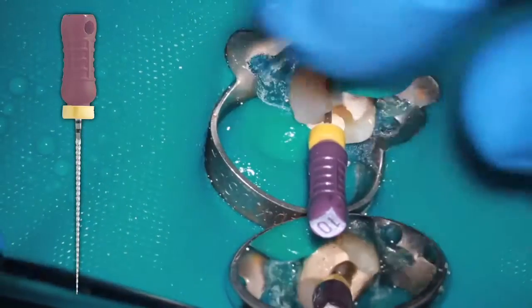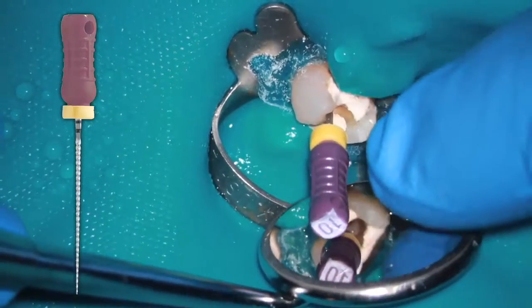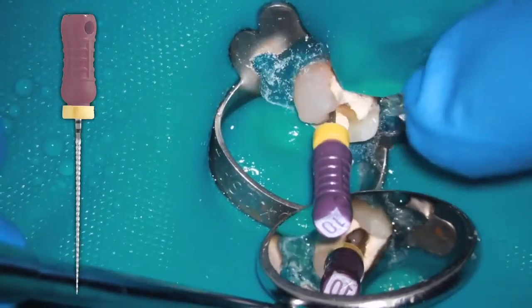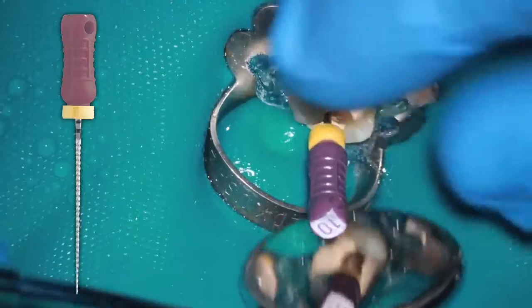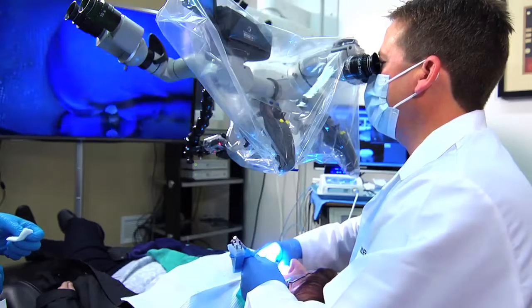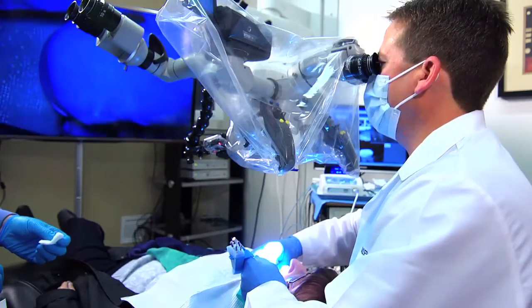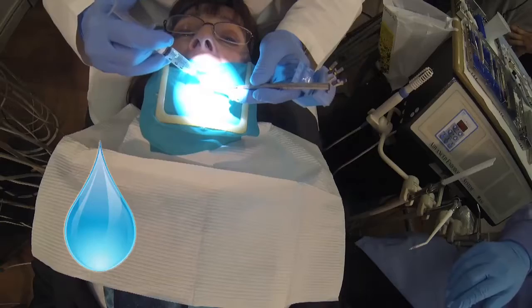What I just did was I just scouted through my coronal segment, thinking of the elliptical canal as two separate systems. So right now I'm working down the buccal aspect and feeling the curvature in my mid-third. Now I'm going to very gently come out and see if there's a similar feel coming from the lingual, which would demonstrate a potential type 4 that I'll see after I open things up. Now I'm going to leave irrigation in my canal system because I'm about to use a rotary instrument.